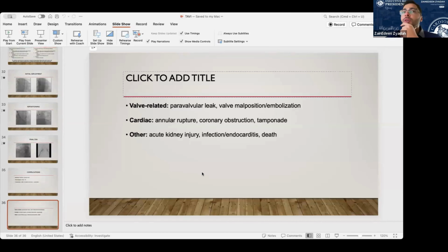I want to know your opinion on TAV procedures. The success rates. Success rates are pretty good. So you're talking about TAV in TAV or TAV in SAV. If the patient has had a surgical aortic valve previously, then obviously the patient has had a previous sternotomy, and they are not always good candidates for a redo surgery. So in those cases, TAV in SAV is a good option.